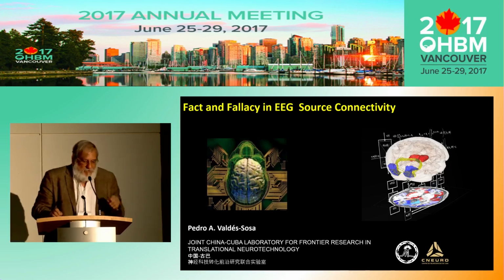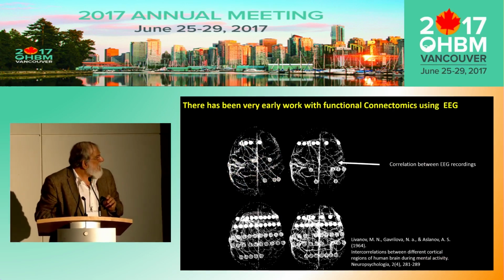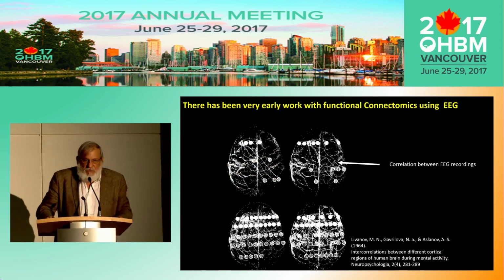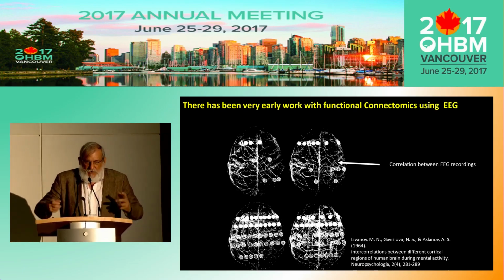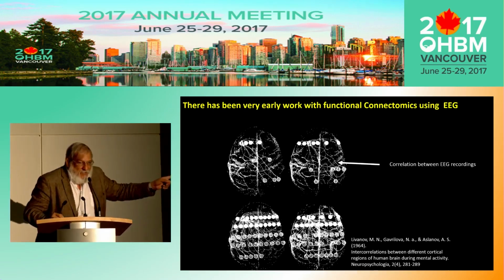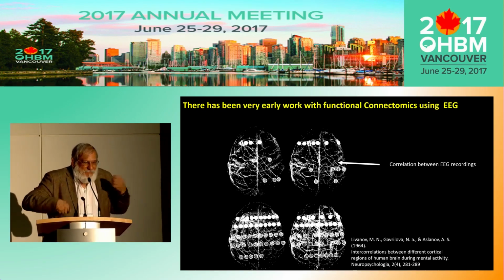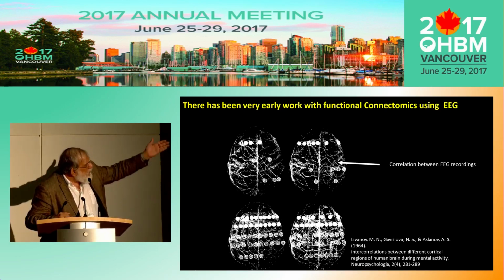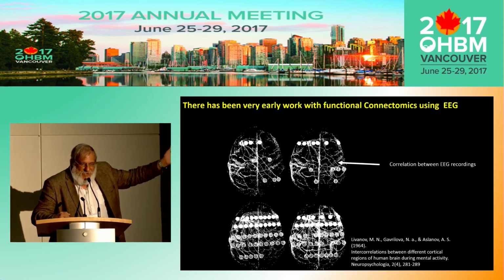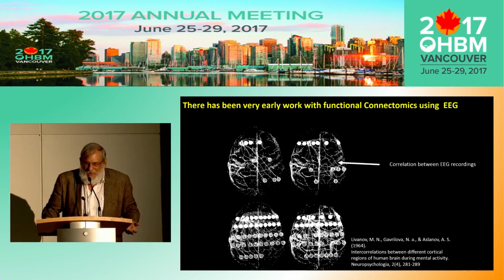Another version of this talk could be, how can volume conduction screw up our estimates of brain connectivity? Basically, it's an exciting new field measuring functional connectivity in the brain. And it's very recent. Oh, oops. It was already done in the 60s by Livanov. This was done actually by using mechanical calculation, and it just shows the correlation between electrodes when a person is resting and when a person is doing mathematics.